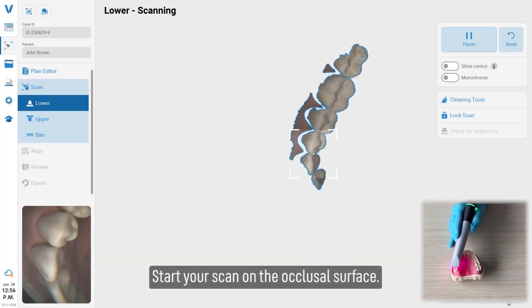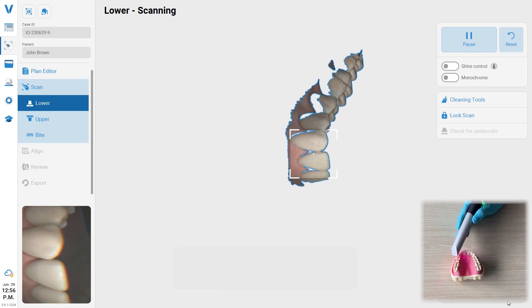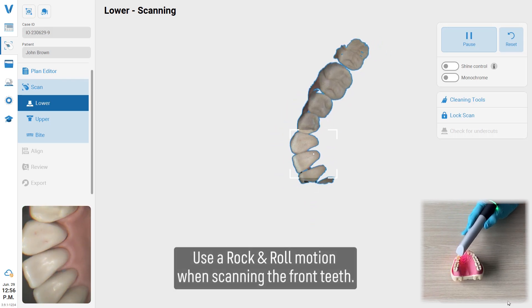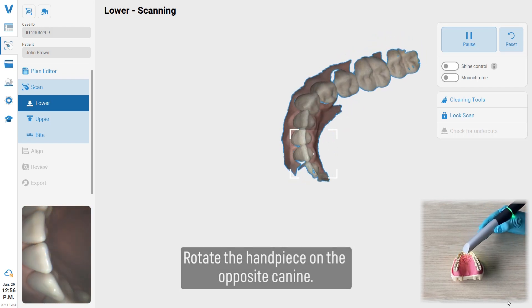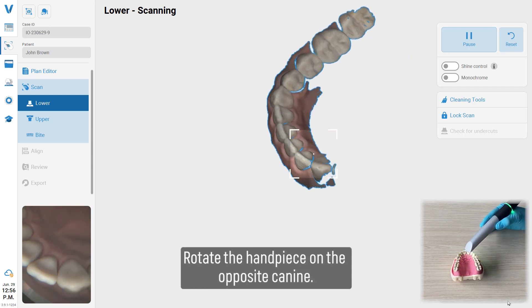Start your scan on an occlusal surface. Use a rock and roll motion when scanning the front teeth. Rotate the handpiece on the opposite canine.